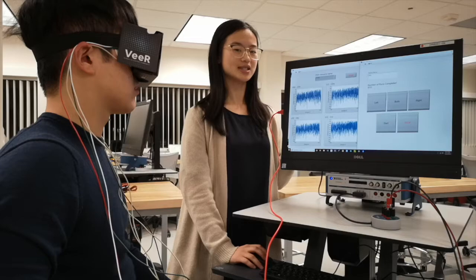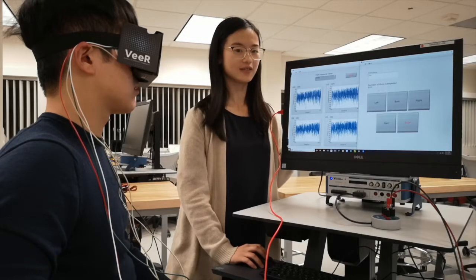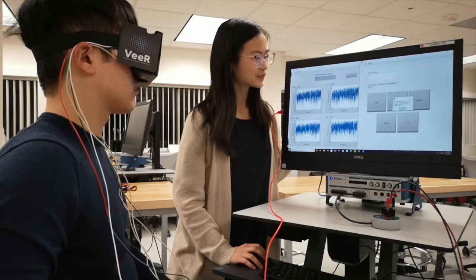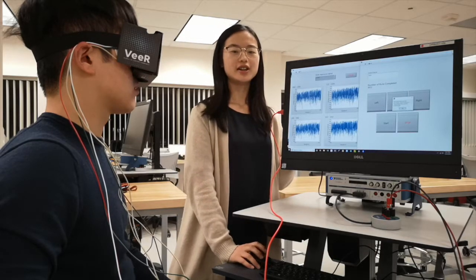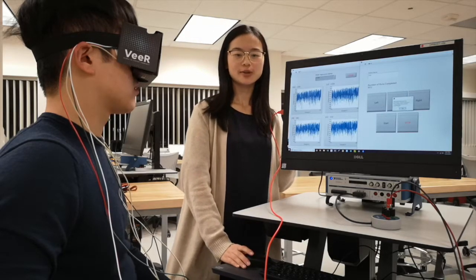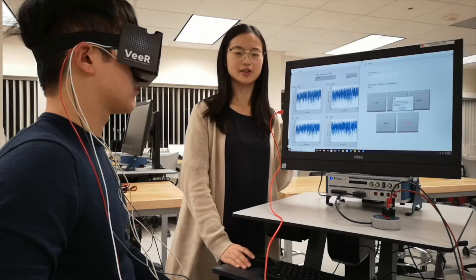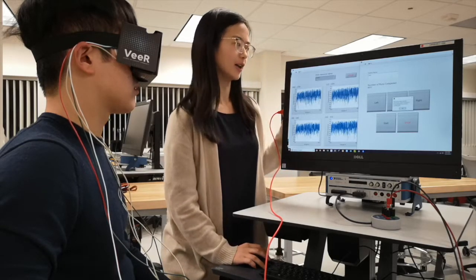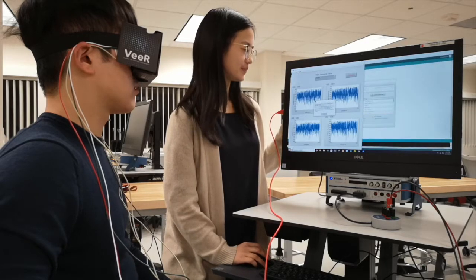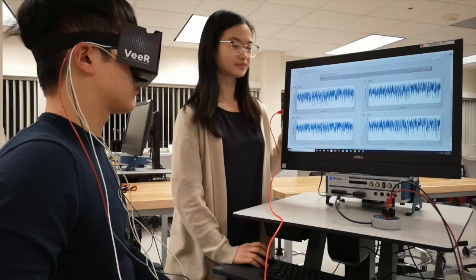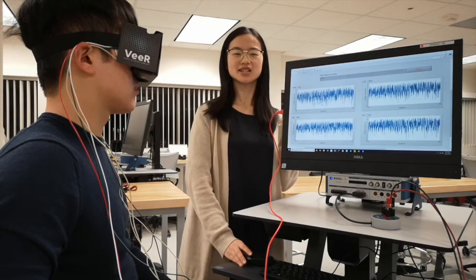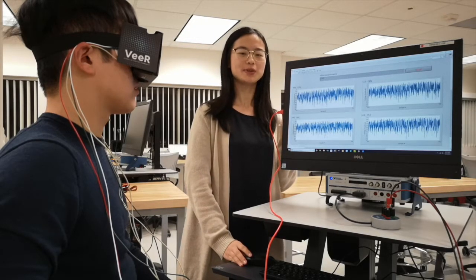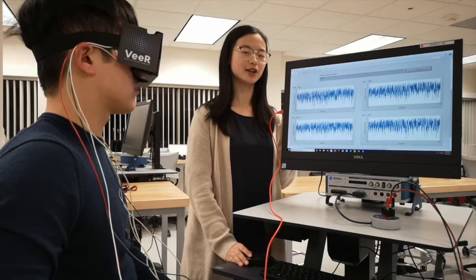Then the test commences. It will automatically save the data. A dialog box will notify the medical practitioner of the name of the file and the location that it is saved. Then the medical practitioner can stop the main VI. After this, the physician can open the files for later diagnosis, but this would be the end of the test for the patient and the medical practitioner.